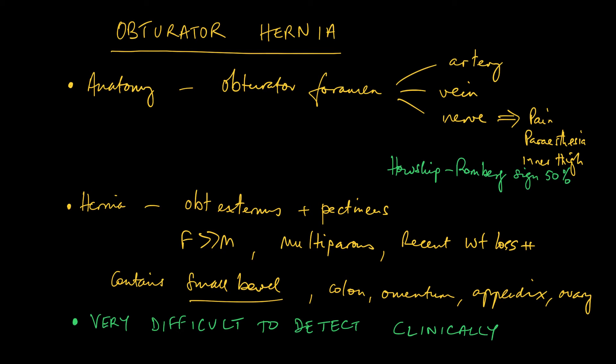The important take-home message for the radiologist is that this is a very difficult diagnosis to be made clinically. The hernia is often impalpable and it's left to CT to pick up the hernia itself. Anyone who presents with abdominal pain and small bowel obstruction, the radiologist needs to look for an obturator hernia, which is a very rare but classical CT diagnosis.